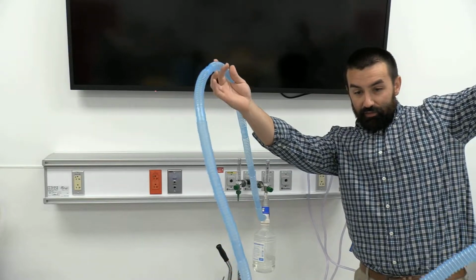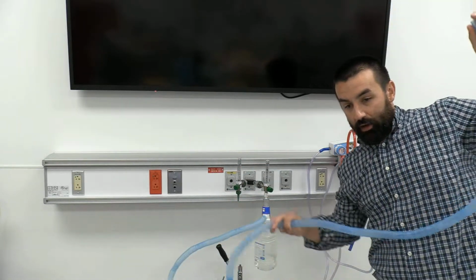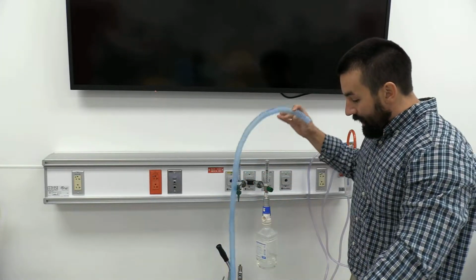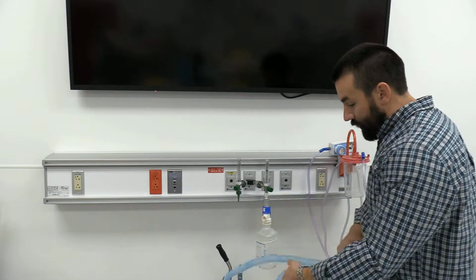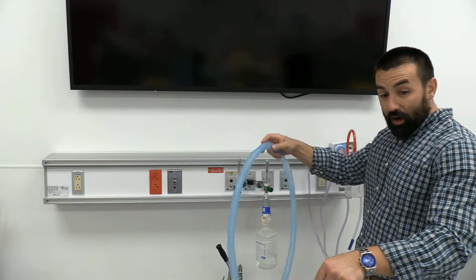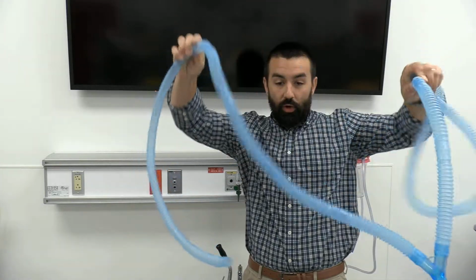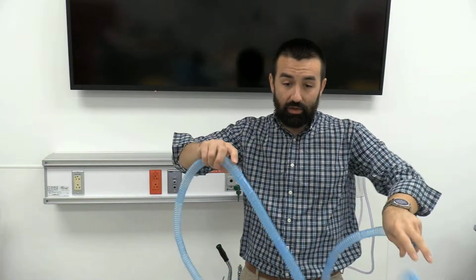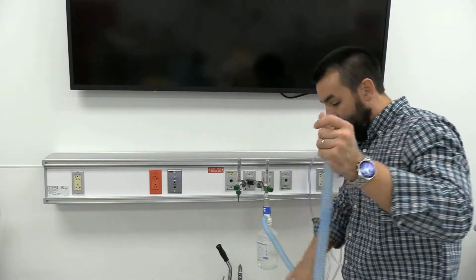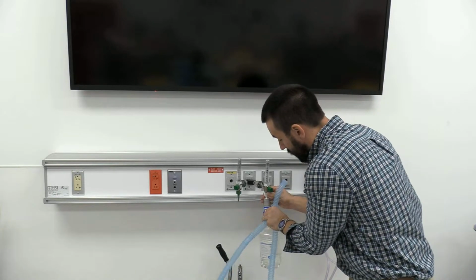It's hard for you guys to see from this view, but this thing is quite long still, okay? So if my bed was hooked up right here, I don't want this tubing really, really long. A lot of times that first line, I'll cut extra short. Especially if the patient's not getting up and out of bed, I'll cut some slack off of this, and that leaves this in an upright position with no chance of it getting turned over or anything like that. So I do make some final connections and trimmings once I get back to the patient's room, get them hooked up, and size up all my distances.